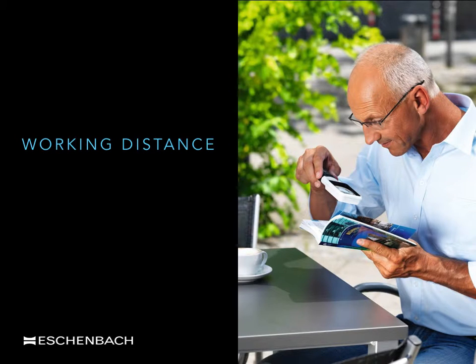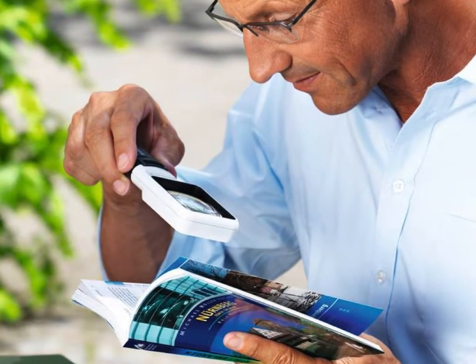Weaker powered magnifiers can be held quite far off the page and the print will still remain in focus. In this picture the gentleman is sitting outside and is looking at a city guide. Magnifiers are quite simple to use. Although one hand is used up, the process of moving a magnifier up and down a column of print is a simple concept. The gentleman is using both eyes and is sitting in a comfortable position.